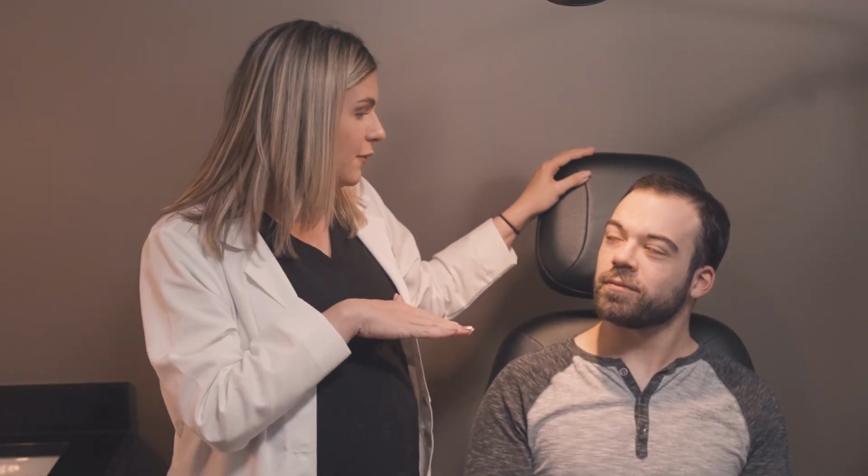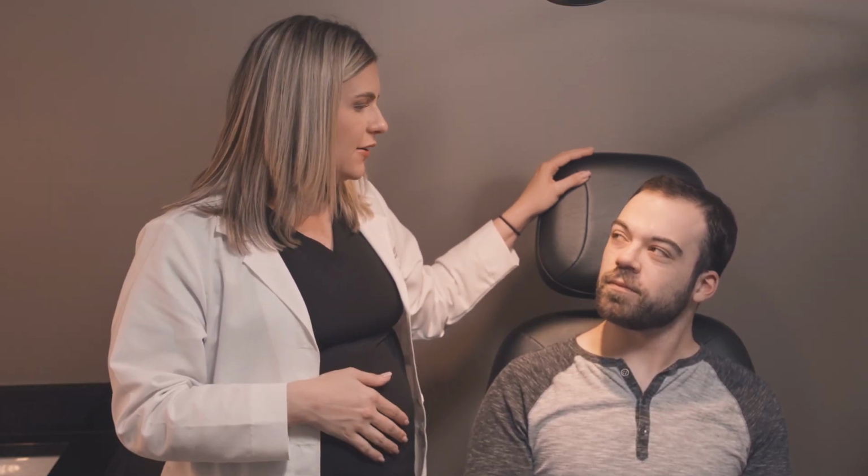Perfect. And it's common to have a little bit of irritation right after we put the plug in, but usually within a day or two, you won't feel it at all. So this is a really common procedure that we perform in the office all the time, and it should last for as long as it stays in the eye. We can always remove it if it becomes a problem, but if you have severe dry eyes, you just had surgery, cataract surgery, LASIK, and you're struggling with some dryness, this is a really great option to help out with keeping that tear film nice and stable and letting those eyes feel less dry.